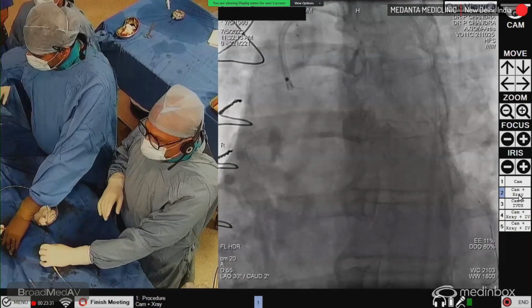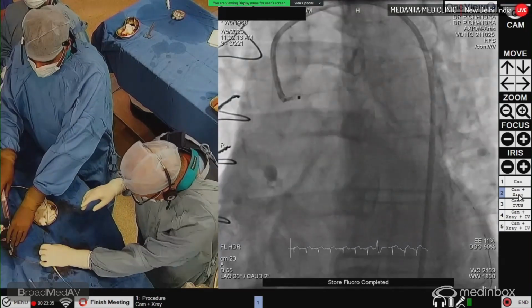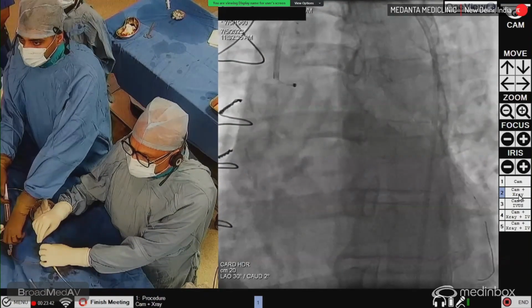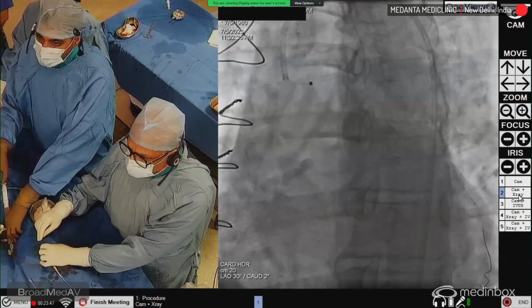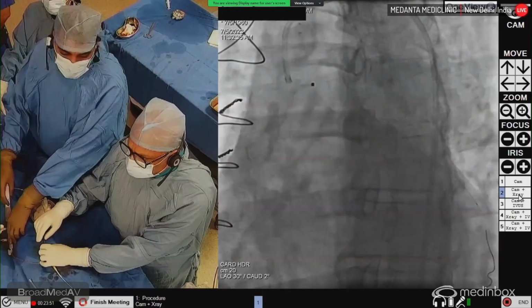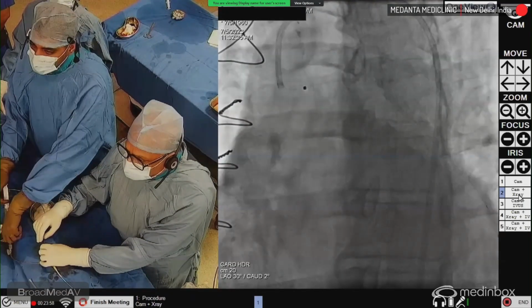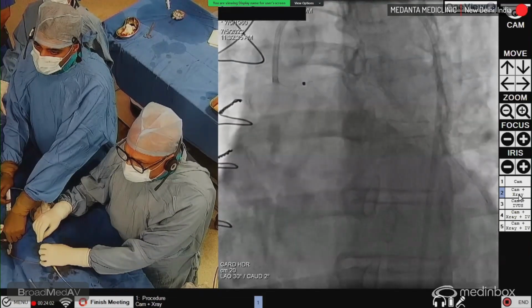You saw that we were able to cross it very quickly, because although it was a tight stenosis, it was really not long at all. So we'll do 1 or 2 more runs. Check. Okay, now it's fine. You don't have to push it at 90 degrees. We are not doing it at angulation because sometimes there is a risk of perforation. Okay, we are ready. Flushing. He's flushing with saline.